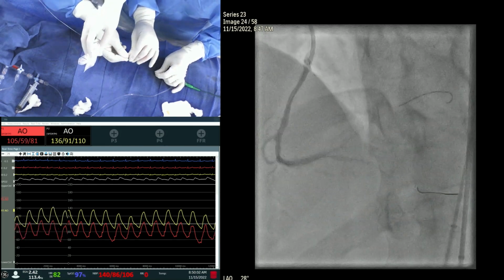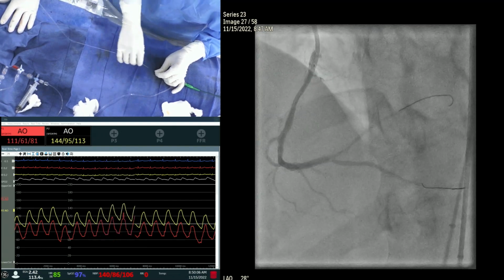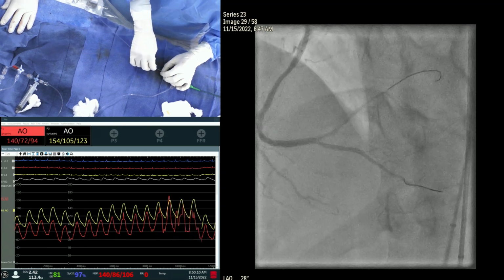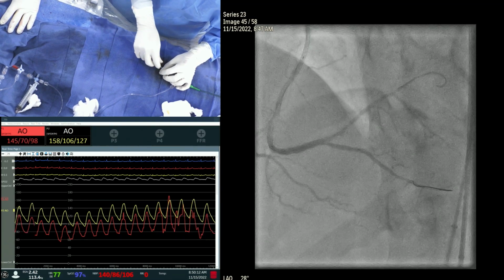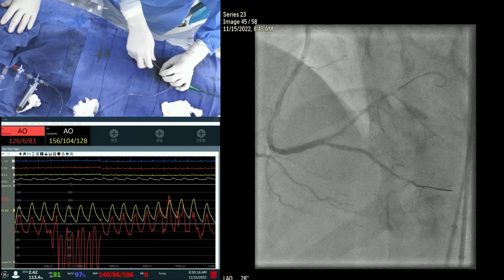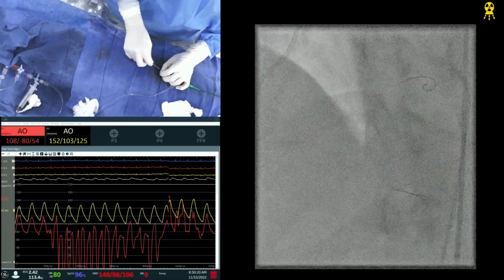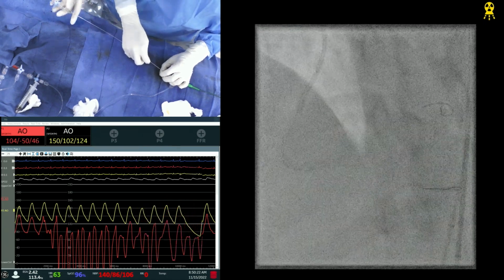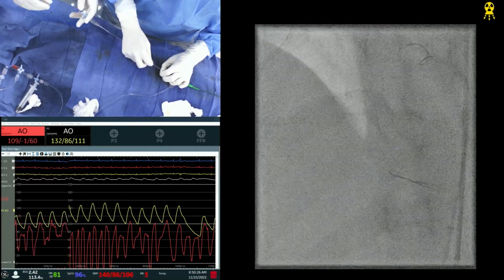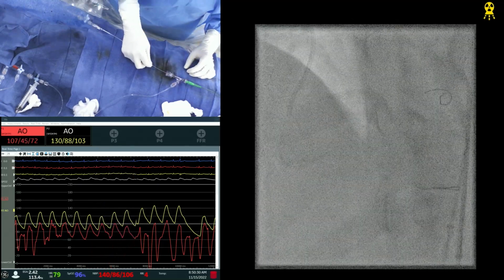In the long term, remember, if the patient goes for CABG, there was never a plan to put a bypass into the posterolateral. The plan was to put a bypass into the PDA. So as long as we can retrieve the PDA and get great results, a little suboptimal result of the AV continuation is fine. Plus the myocardium supplied by the PDA is always larger. Okay, good. So this is the 2.5 into the 20. We want to get a good balloon result. Okay, I'm going up.